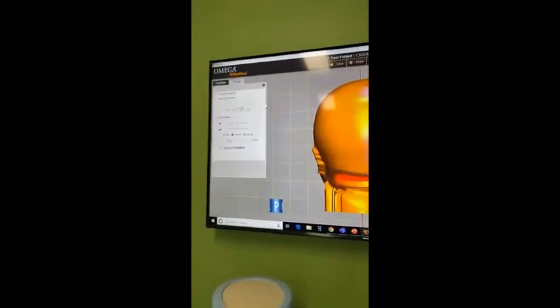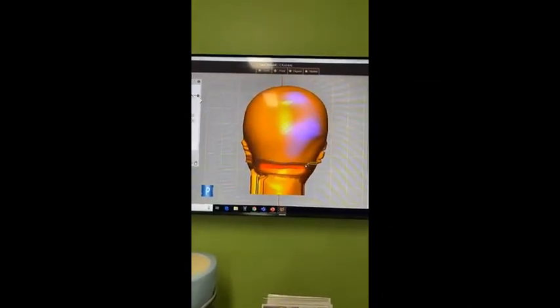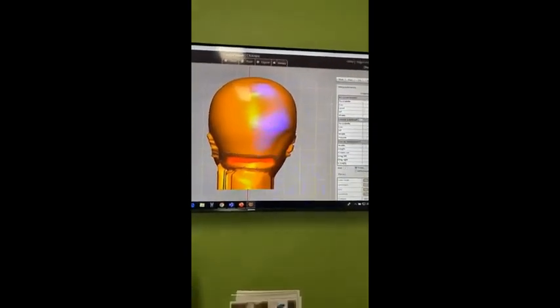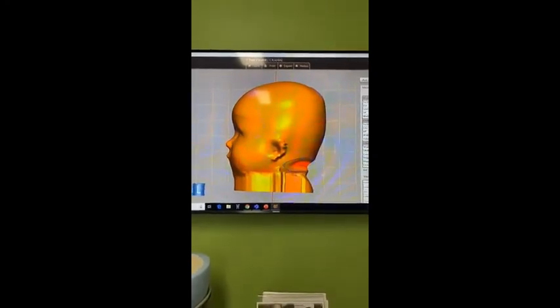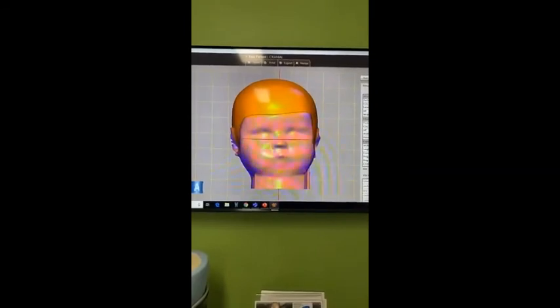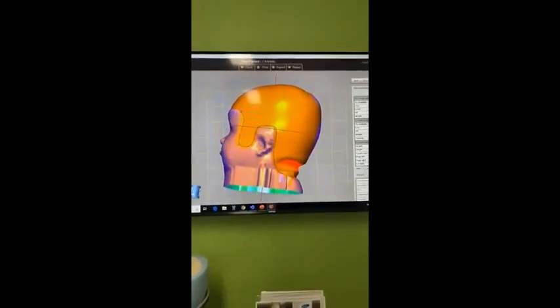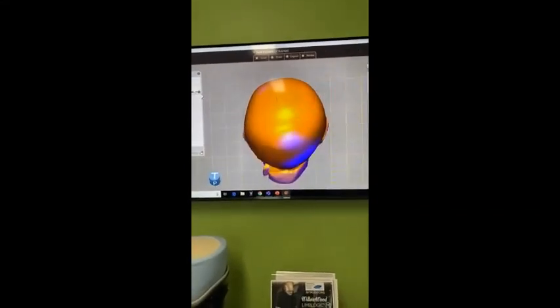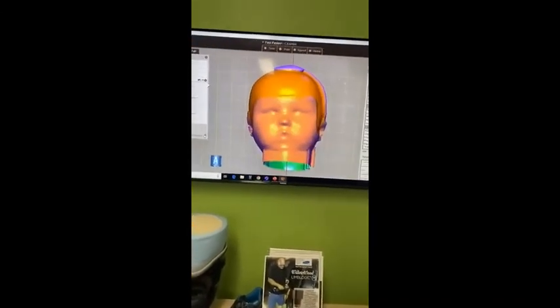You've got other tools where we can create kind of compression around different areas, especially the sub-occipital area. We can help stop rotation when it's on the head. Trimline tools, we can basically create trim lines on how you want it all cut off, and we also can create the top trim line and the seam.